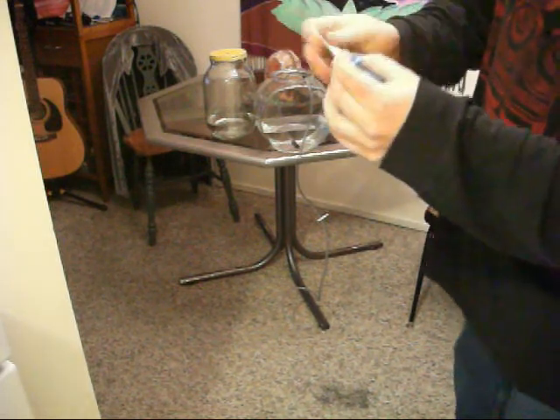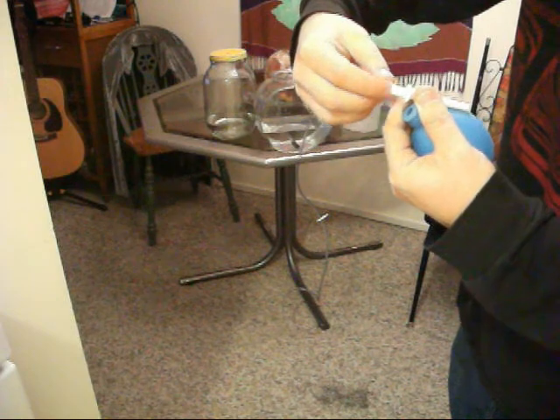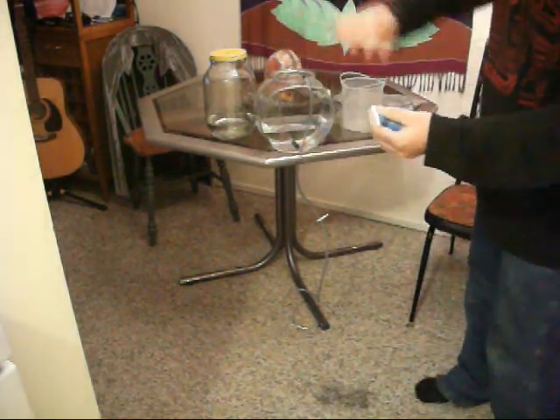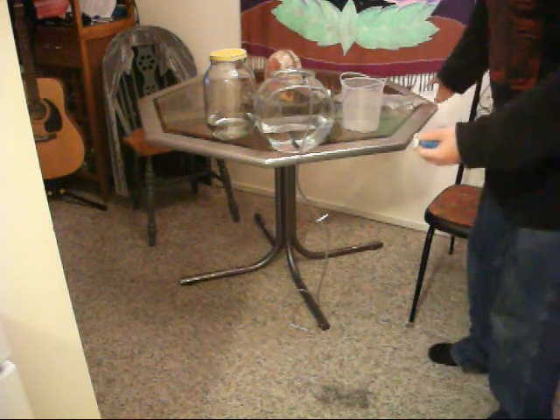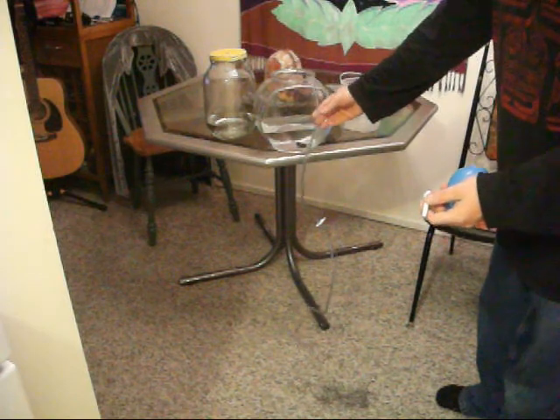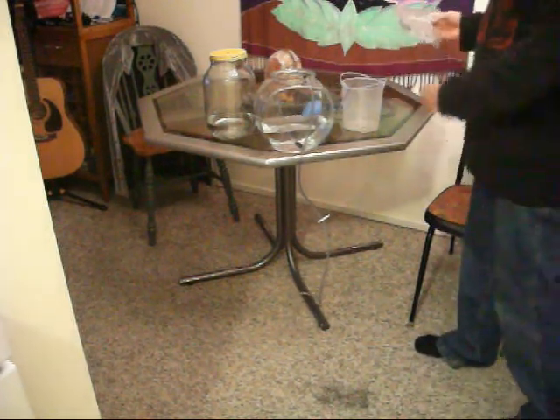So another version is you get this, and then this part here, you get a plastic piece that fits around that, just snug right inside there. There's ways to modify. If it doesn't fit perfect, add a little bit of electrical tape and then stick it on, and then that'll insert in, and then the other end will go in there, and it's the siphon principle as well. So that's another option. And then you wouldn't even need to buy the disposable bag. You could just buy this plastic tubing, and one of these, or just a tip, or make your own tip. I mean, there's so many options, but what I recommend is it's so easy.